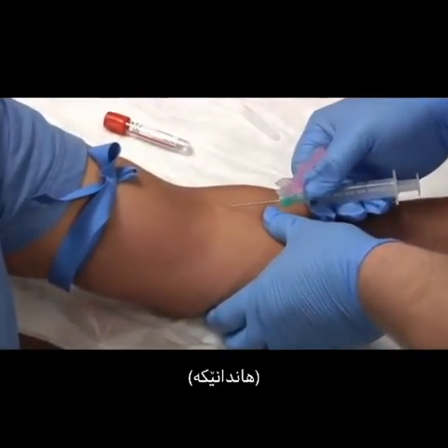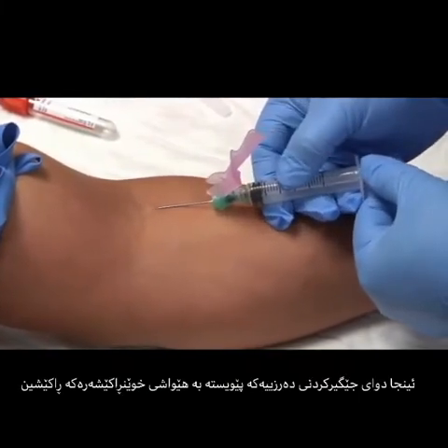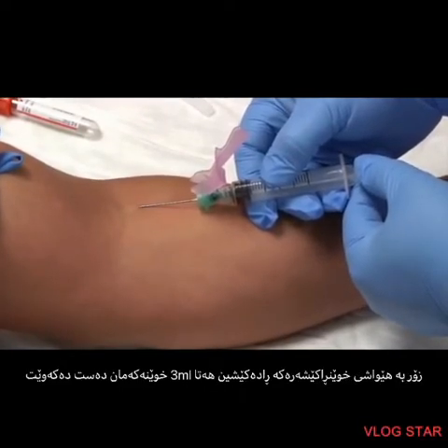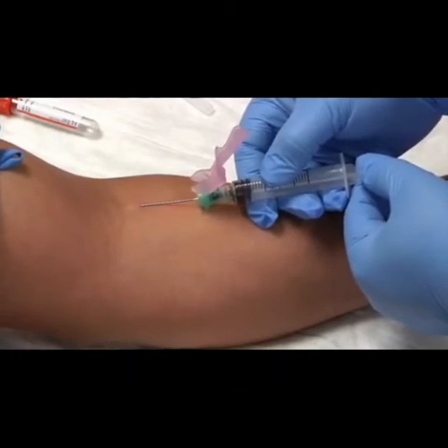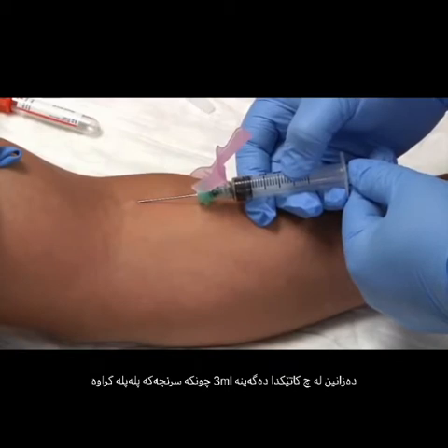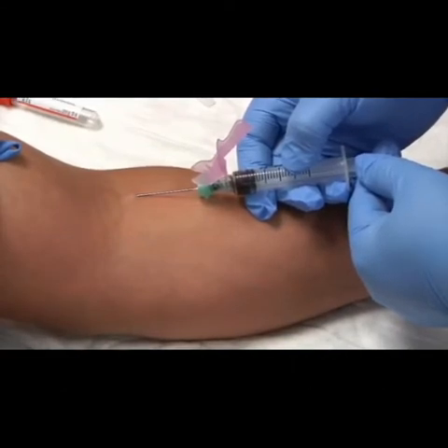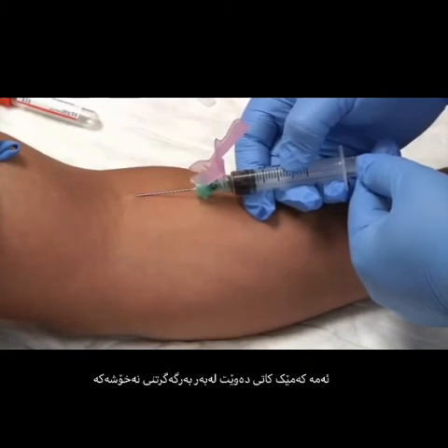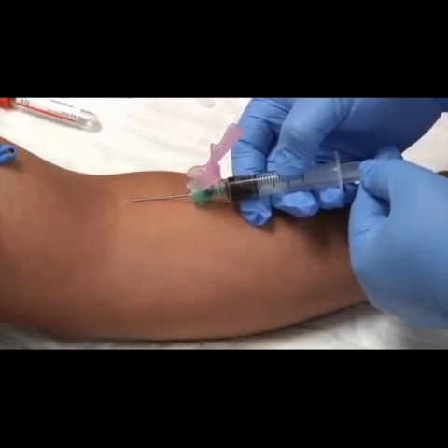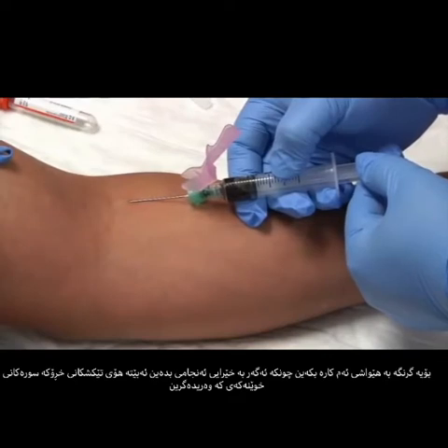Anchor your vein and — one, two — stick. You want to slowly pull back. With this test I'll be performing, it's a serum test and I'll need three milliliters of blood, so very slowly pull back the plunger until you have three milliliters. You can tell because the syringe is a graduated cylinder, which means it's been marked on the side. Gradually pull back your plunger — this takes a little time since our patient cannot tolerate suction from regular tubes. It's also important to go very slow because pulling back too fast can hemolyze the specimen.